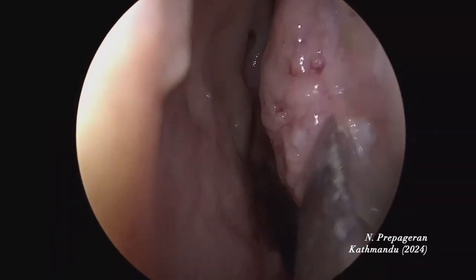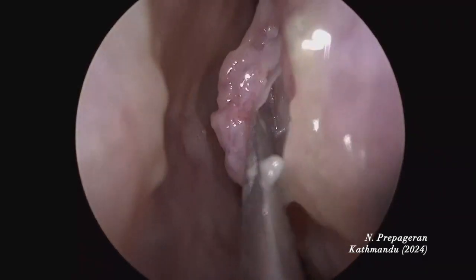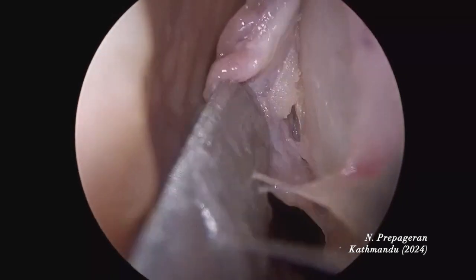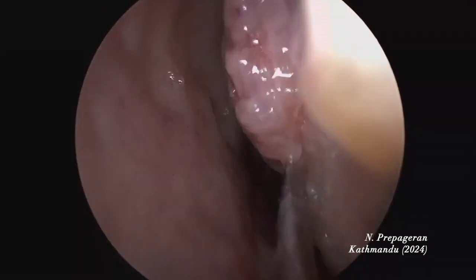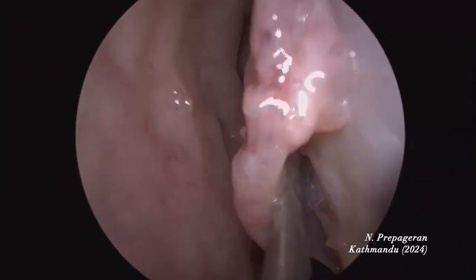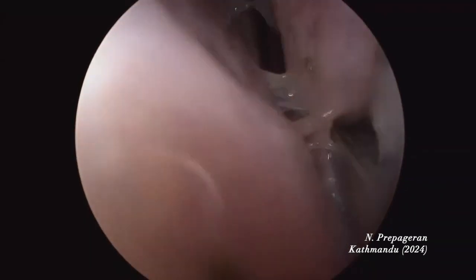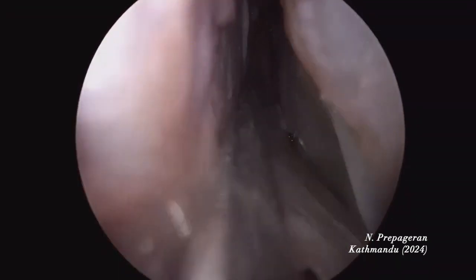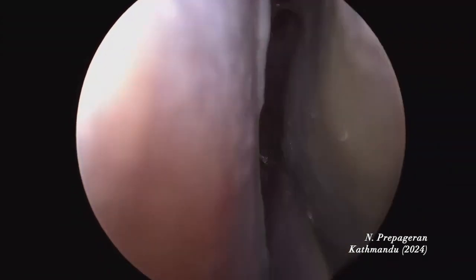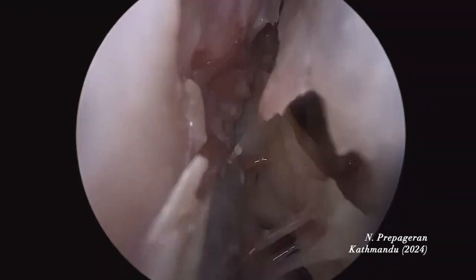To raise a septal flap in a cadaver is always difficult because the tissue plane is gone. It's much easier to do this in a living patient. Getting the subperiosteal plane in a cadaver is not so easy. Now I'm exposing it to the keel all the way here.